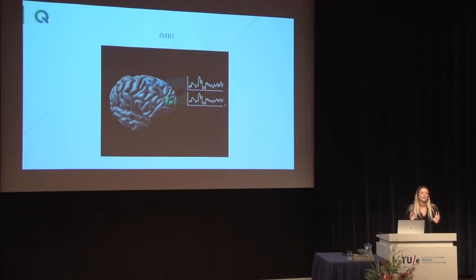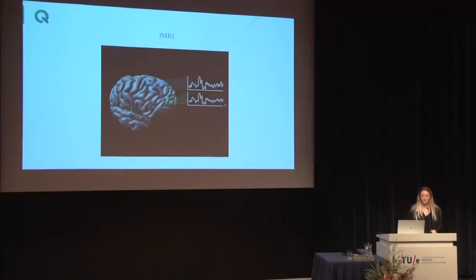And then when we talk about connectivity, there's also functional connectivity. So this MRI scanner is very versatile. You can program it also to get images for functional connectivity. In this case, what MRI is sensitive to is the increase of oxygen in the blood. So as you see here, for two regions, we can measure the time series while the participants are performing some task or just resting. And then if we want to know if two areas of the brain are working together, if they're functionally connected, we can correlate these two time series.